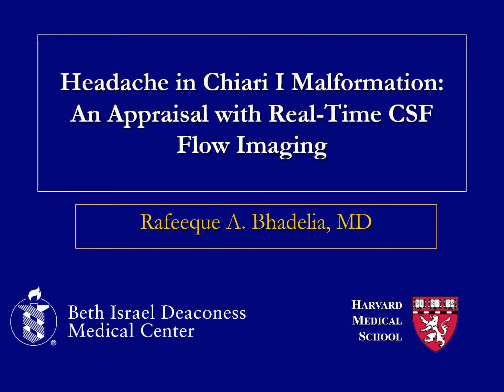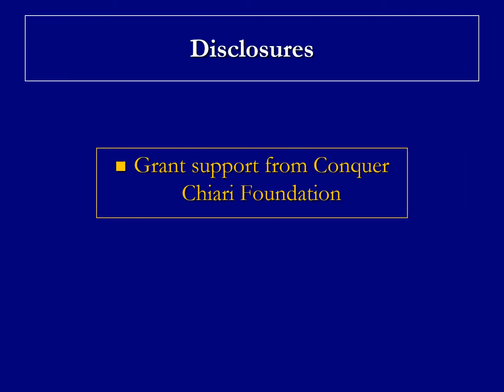I am a neuroradiologist in Boston, and today I'll be talking about how to assess headache in Chiari malformation patients using real-time cerebrospinal fluid flow imaging, a newly developed technique that we are using, which is different from the CSF flow imaging performed routinely. This study was supported by a grant from Conquer Chiari Foundation.